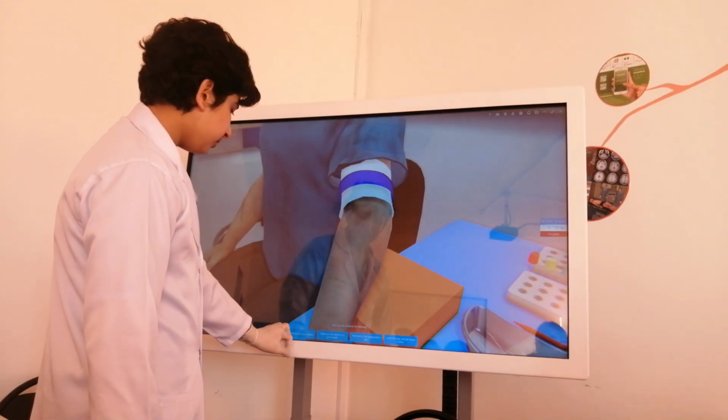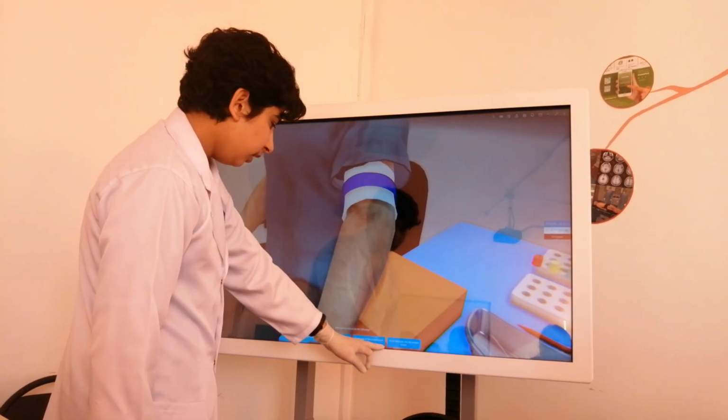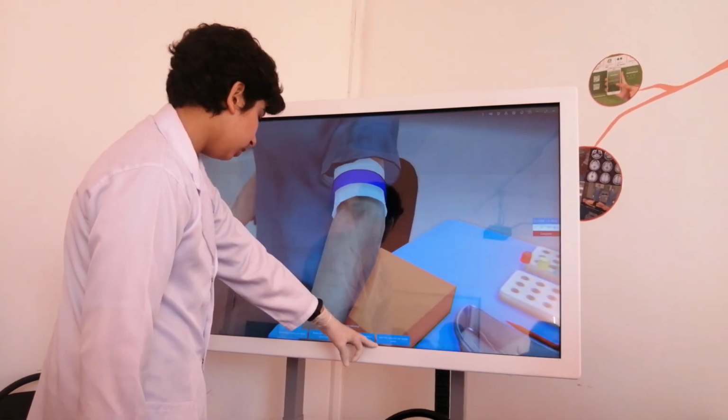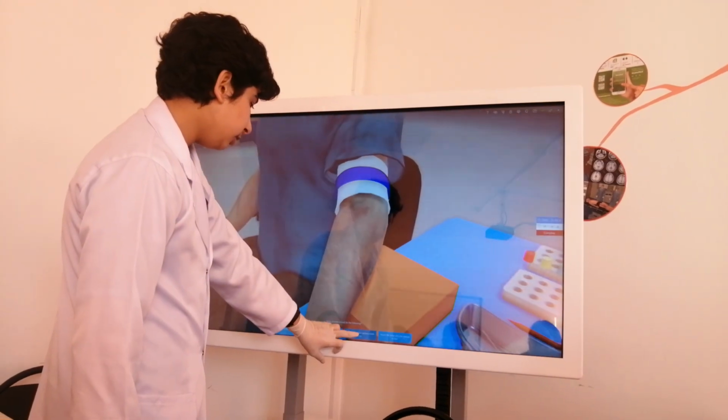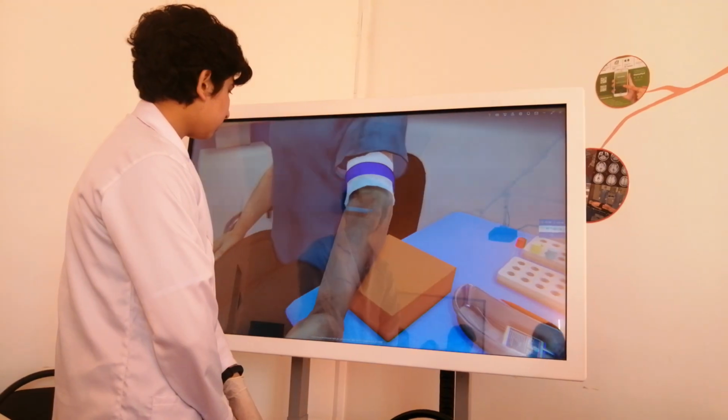Assembling the vacuum system. Make sure the patient is in good health. Treatment of the venipuncture site. Insert the tube into the needle holder. Treat the puncture area with an alcohol wipe. Wait for the alcohol to evaporate.